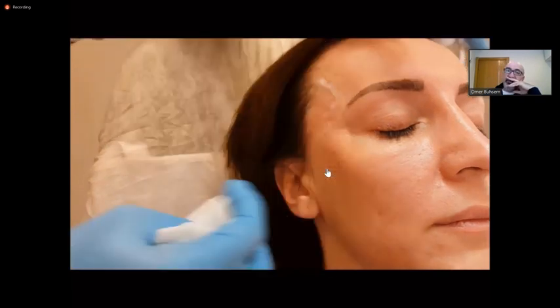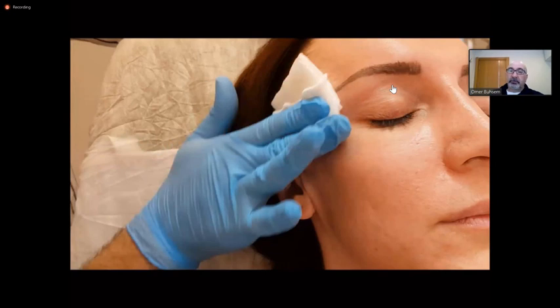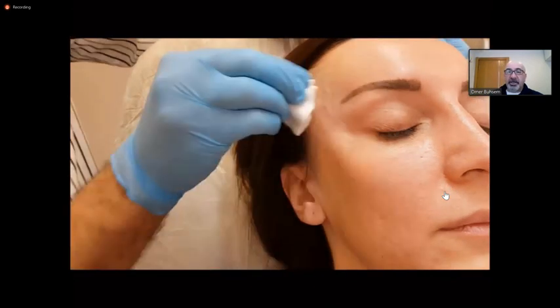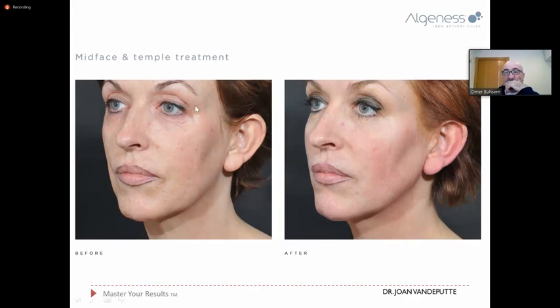Okay, now it's finished. If you need 3 weeks later or 4 weeks later, you can do another injection. After massage, you can see the veins here, superficial veins. This is after massage. Okay, really plain surface, no irregularities if you inject deeply. If you inject superficially, it's a different technique. I can talk about it later if someone wants it, how you inject the superficial layers. But for Algeness, this technique is I think the most suitable technique for you.